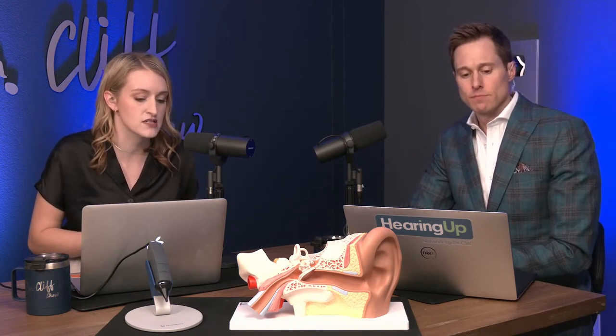But let's go ahead and recap for everyone what we talked about today. Most definitely. So again, going back to the very beginning when we're talking about case history, the main goal of case history is to really gather information about your health and your hearing. This is a very individualized process. This is your healthcare. This also helps us in determining the correct treatment plan down the road, ending up with really individualized care, an individualized treatment plan.